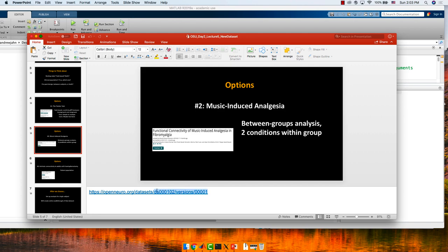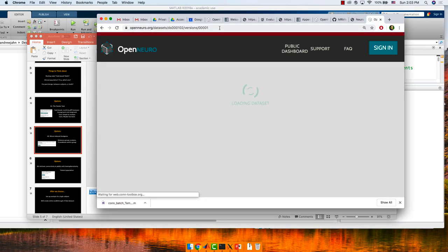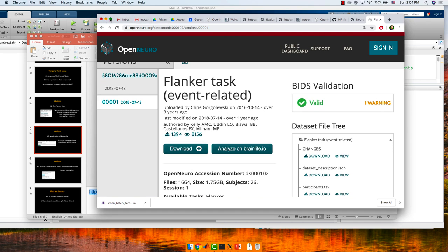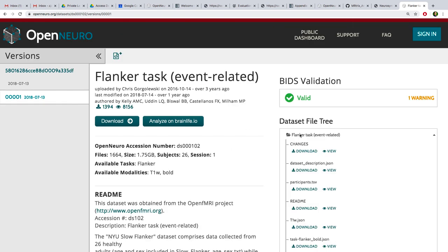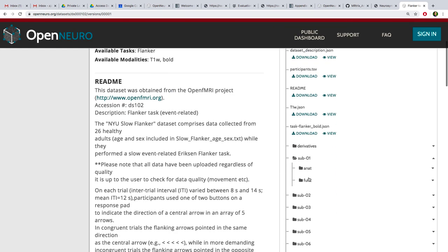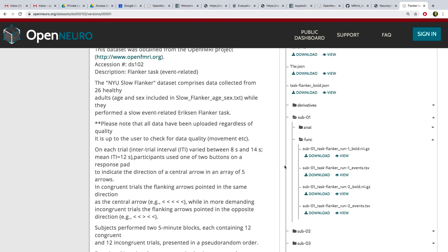If you go to OpenNeuro and search for 'music-induced analgesia,' you should be able to find it. I have a link right here so I'll just follow that. Let's get acquainted with this. They don't have resting state, but we will be able to do a GPPI analysis on this particular one and compare groups.